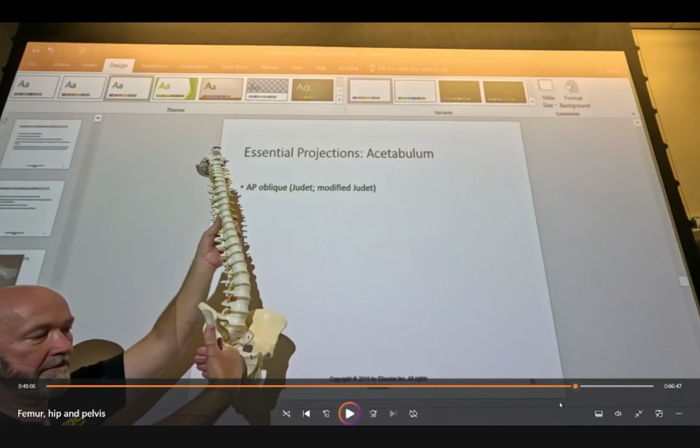So before I rotated it, both iliac wings were at an angle to the camera. All the anterior pelvic bones were also at an angle. So as I rotated this up, what happened is the downside iliac wing flattened out. So the upside iliac wing became more lateral.